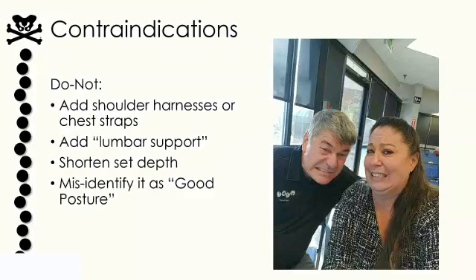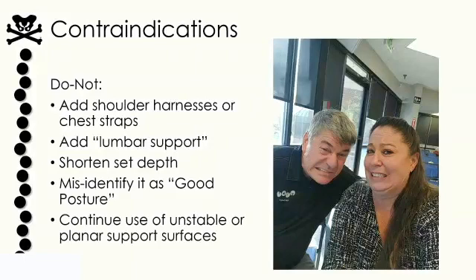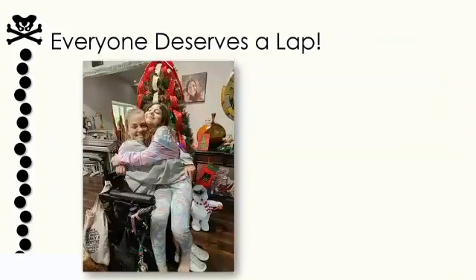Some people like to sit up really, really straight, and they can have great posture, but then it can start tipping too far forward. So really watch those lower level paraplegic injuries who have some abs and really want to sit up tall and can then start tipping forward and be too straight. That often happens in my active veterans because they want to have that great posture they used to have. And please, please, please intervene early and give supportive surfaces that are nice and stable and supportive for them. Summary you can read on your own.